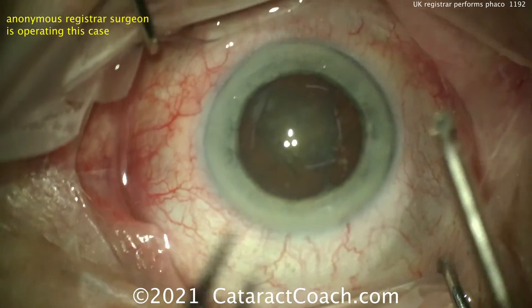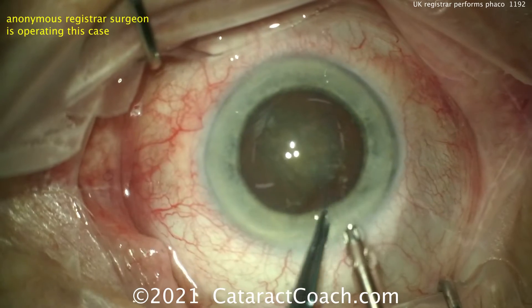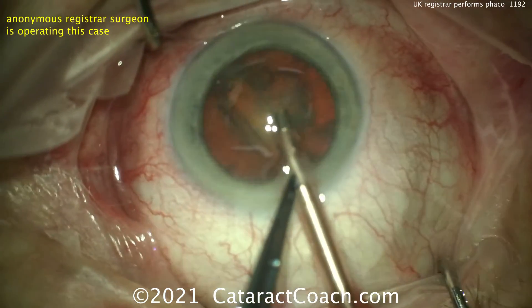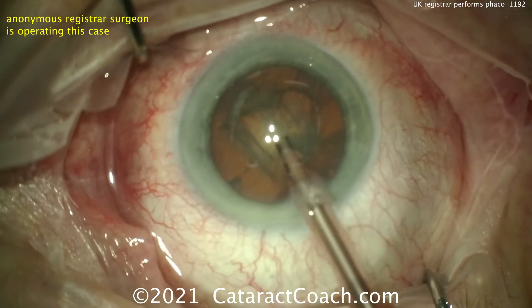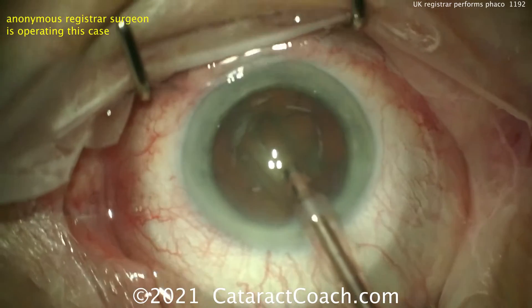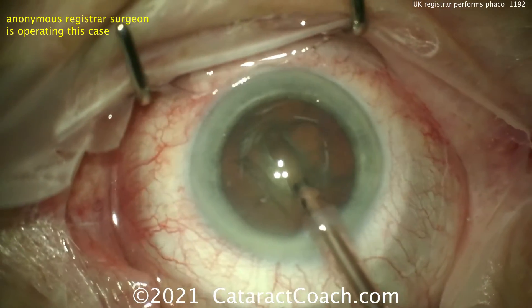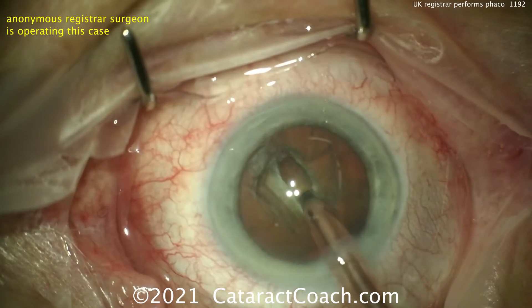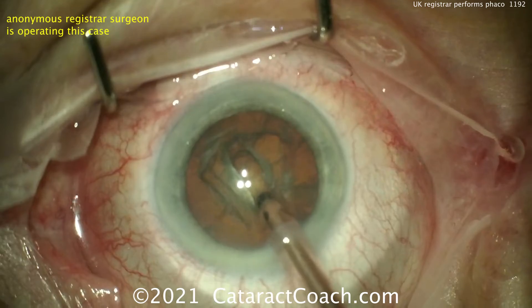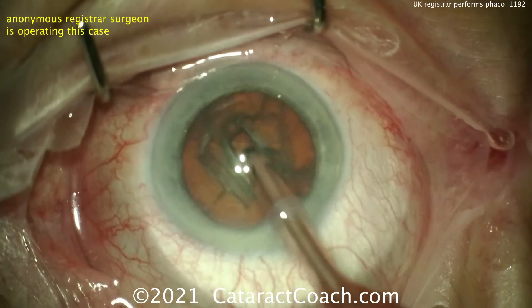Here comes the PHACO probe. Now I'm watching this video for the first time with you. This young doctor sent me this video and asked if I could do a review and give some pointers. The PHACO probe looks like a central groove is being made. Right in the middle, the groove looks really quite good — starting sub-incisionally, a little deeper in the center and shallower in the periphery. That's pretty good depth already. Maybe just a little right there in the center; I wouldn't do too much more than that.